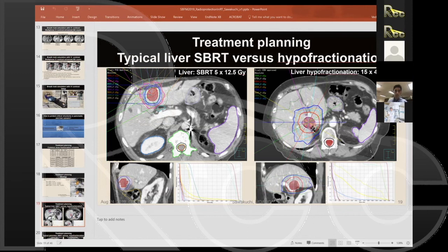And Sastry, do you remember what it was like the first time that your center was transitioning to do pancreas SBRT and liver SBRT for the first time? I'm sure it was very exciting and scary. I will confess I was not involved for that first treatment. It was probably Dr. Sawakuchi, and he would express a very similar sentiment. But that said, we've had prior experience with a very strong lung SBRT program. So it's not like we straight away went into liver SBRT and pancreas SBRT. We have a lot of experience with lung.